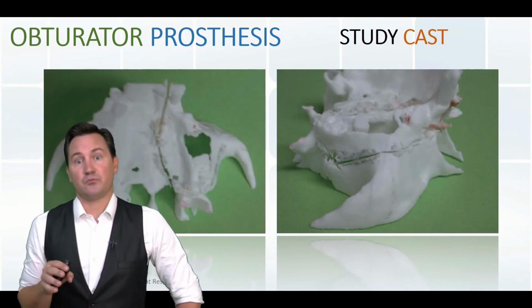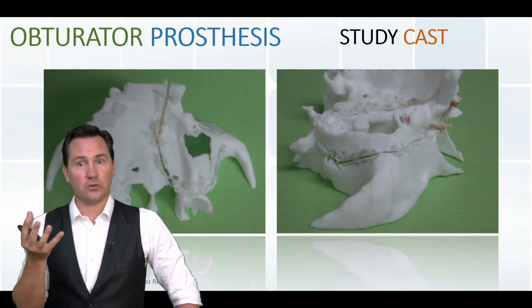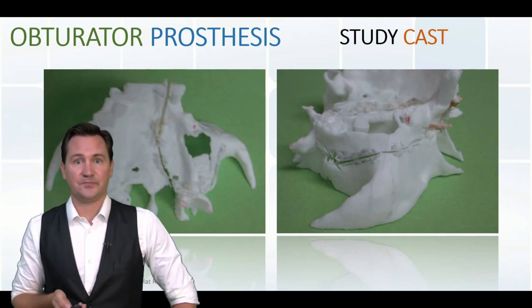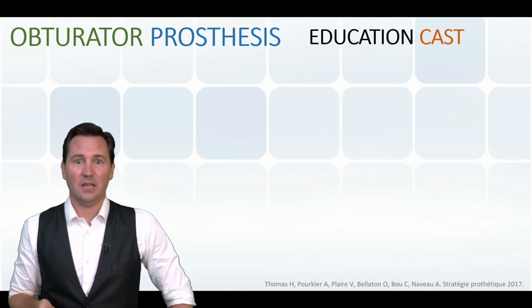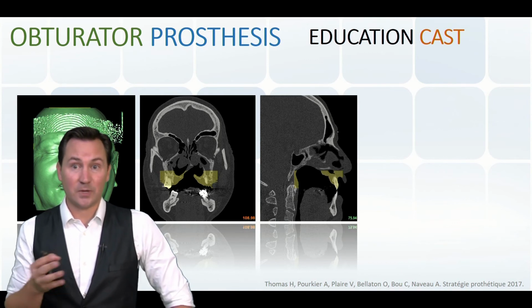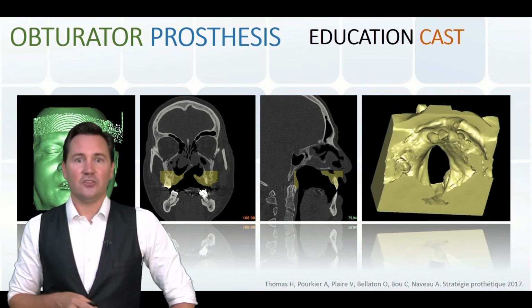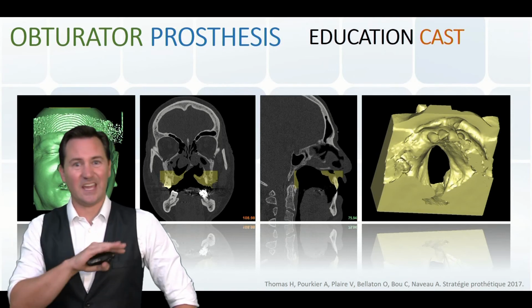First, the surgeon can print out the maxillary bone to plan the surgery. This 3D cast can also be used for discussing with a prosthodontist or for educational purposes, either with the patients or with the students. It's very simple to perform if you have access to a 3D printer. With any free software, such as ITK-SNAP or Osirix, you can do a segmentation of the area of interest on the DICOM files. The software will create a digital 3D model, and you can modify or select anything you need.